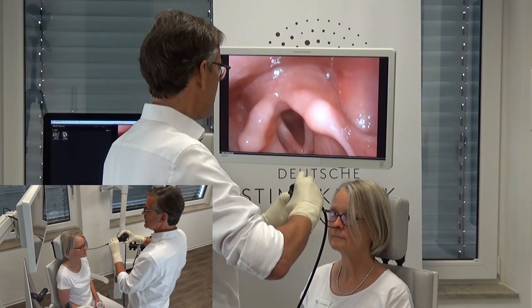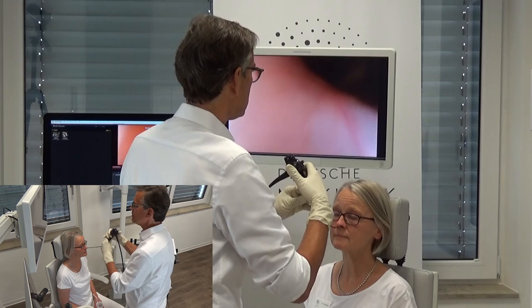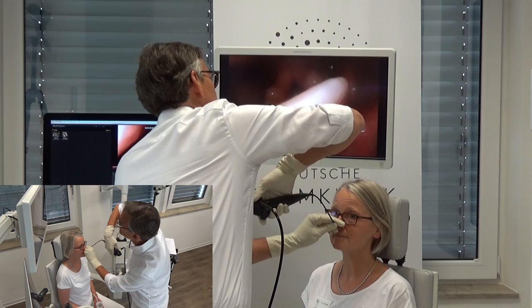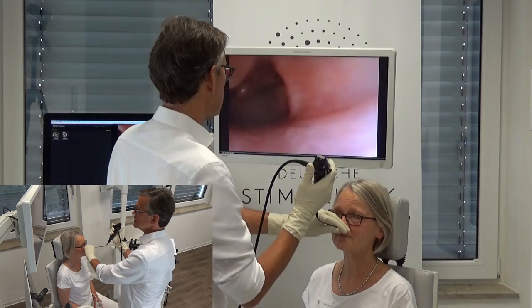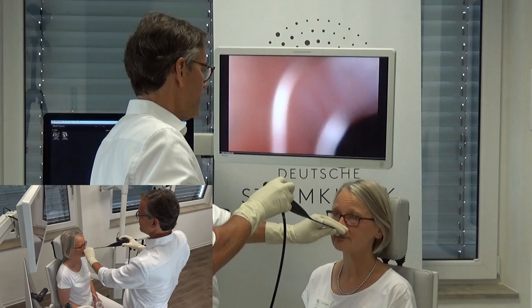Let me take this endoscope and hold it with my thumb. If I hold it with my thumb, the rotation is not as easy — as you can see, I have to lift my arm to go 180 degrees. This is not very convenient for me as the endoscopist. That's why I prefer this kind of handling, because here the rotation goes very smoothly.